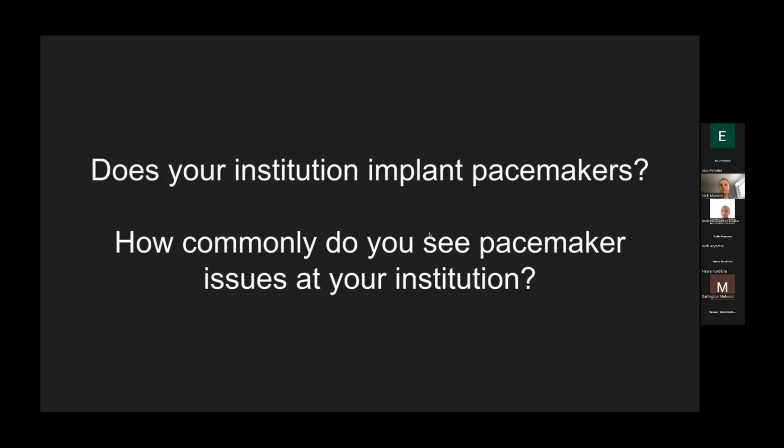Emmanuel also touched on what the contraindications to pacing are. So if someone's pacemaker is failing and you need to take control, you need to consider, do you have availability of a transcutaneous pacemaker or a transvenous pacemaker at your shop? We definitely should not be putting in transvenous pacemakers if we're not trained how to do that. That would be certainly concerning and dangerous. That's an invasive procedure, so that should be deferred to an emergency medicine physician or to a specialist like cardiology, vascular surgery, that kind of thing.